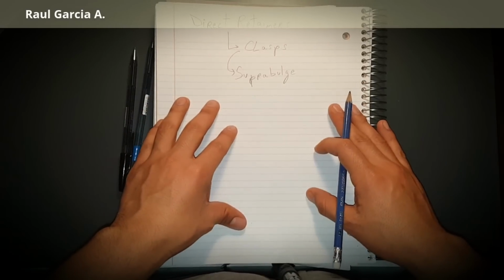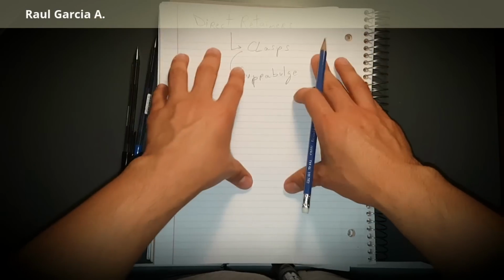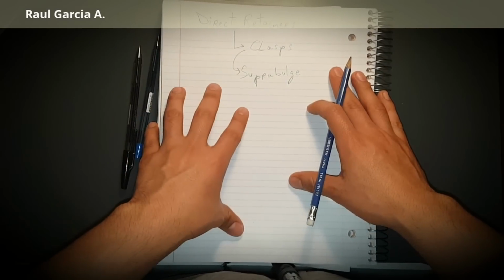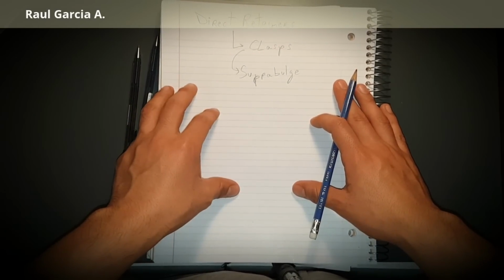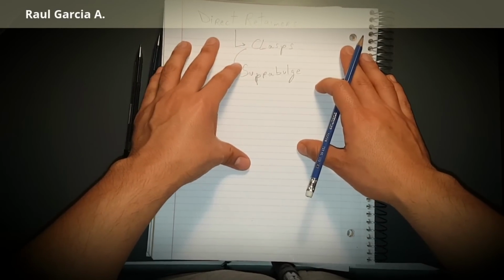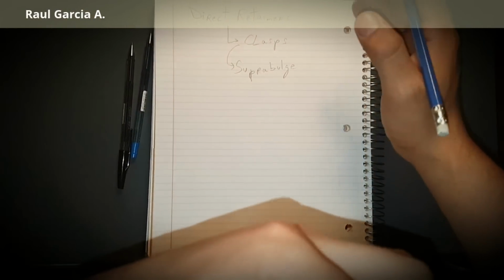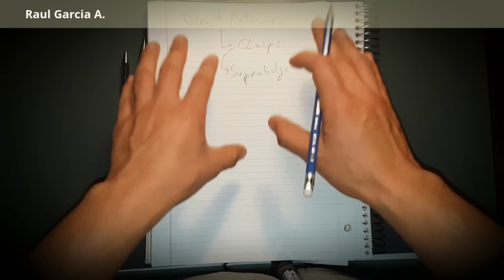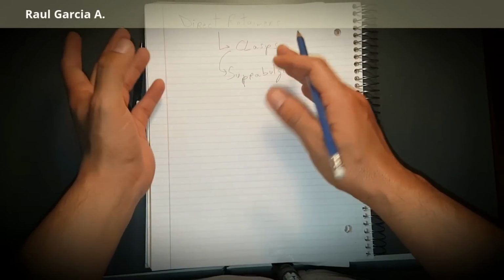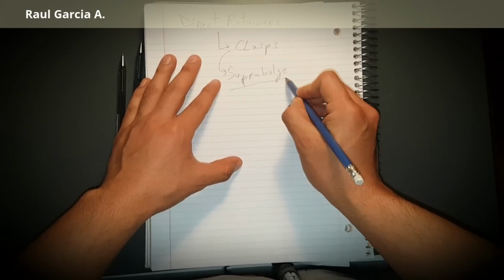So hello everyone. Today I'm going to show how to draw properly and to understand when to use which clasp when we design RPDs. So I'm going to start talking about the direct retainers. Remember, when we design an RPD we have direct retainers and indirect retainers. Our direct retainers, which is our topic now, are the clasps. We know that we have two types of clasp, the suprabulge and the infrabulge. First we're going to see the suprabulge ones.